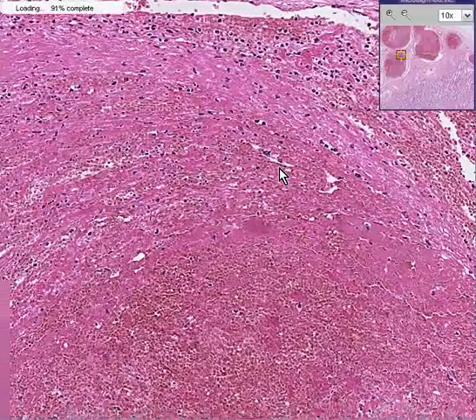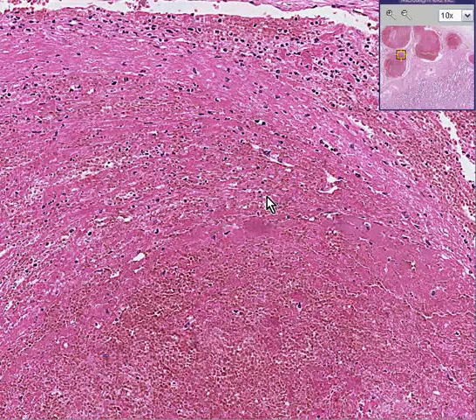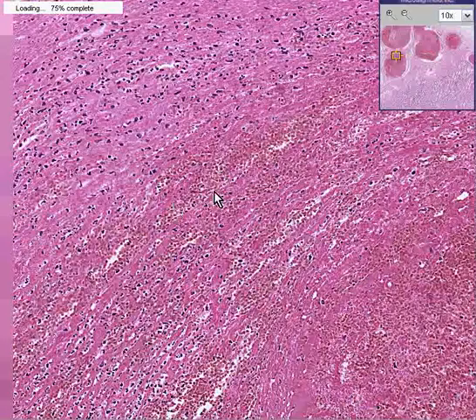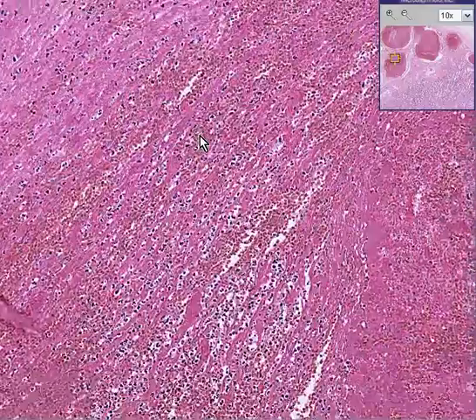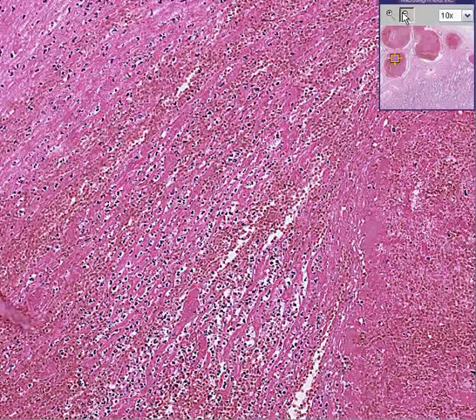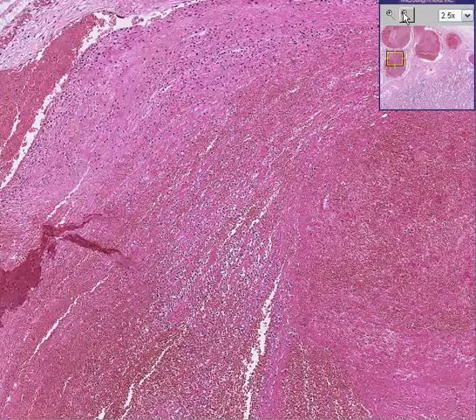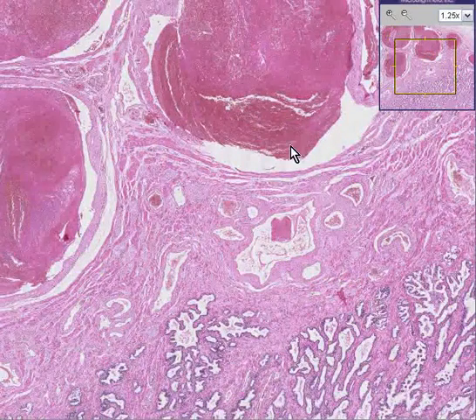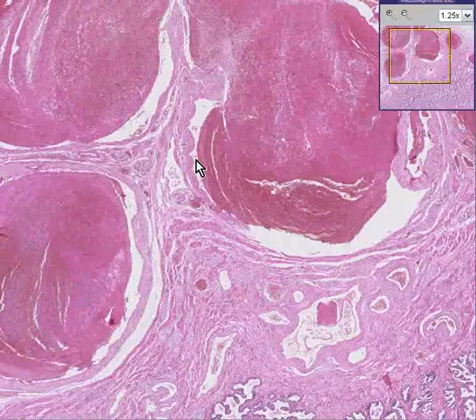I think you might recognize the fact that perhaps here, in here, in here, and maybe here, we have some vascular spaces, some ingrowth of capillaries, which makes this organizing. Technically speaking, what we really have here, and all I really want to say, is we have organizing thrombi within a prostate, in the veins, in the periprostatic venous plexus. Thank you very much.